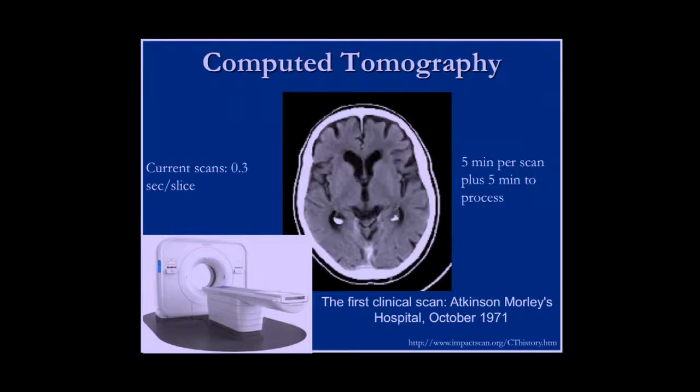So very quickly, the device looks like this. One enters this tube, the X-ray rotates around you very rapidly and can acquire a volume of your brain. And let's see now, 0.3 seconds times probably like a minute, very quick nowadays.